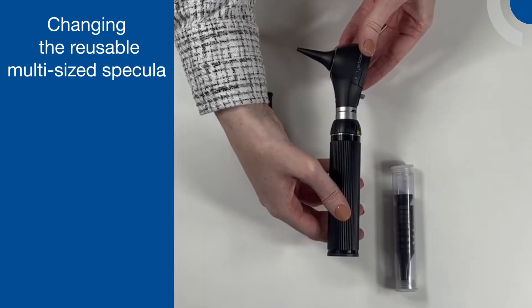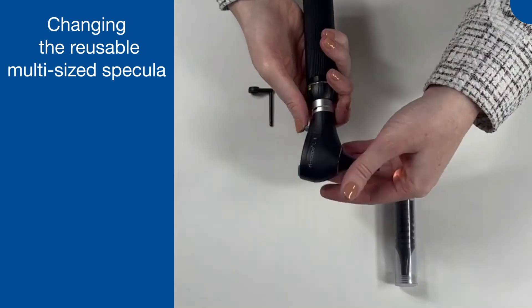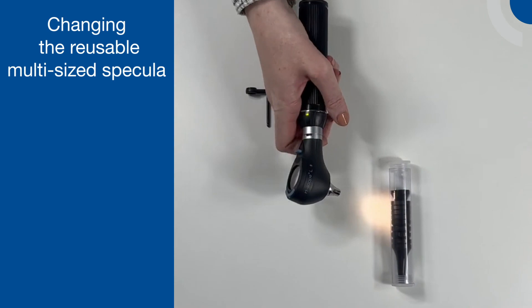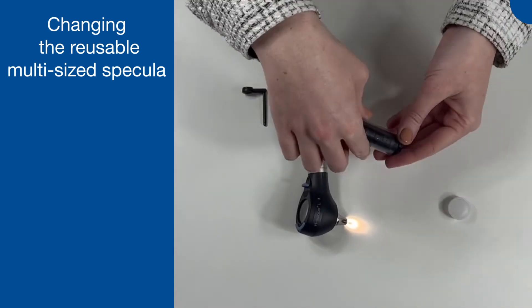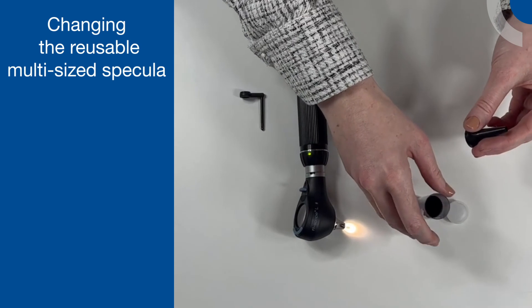To eject the specular, press down on the blue button beneath the swivel lens. You will hear a slight rattle from the otoscope head when there is no specular attached. This is normal and means that the spec eject feature is not engaged.